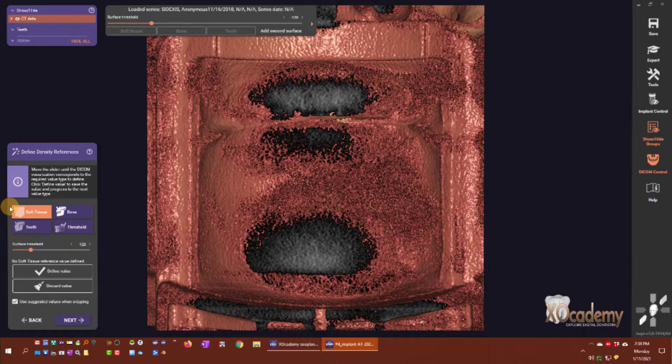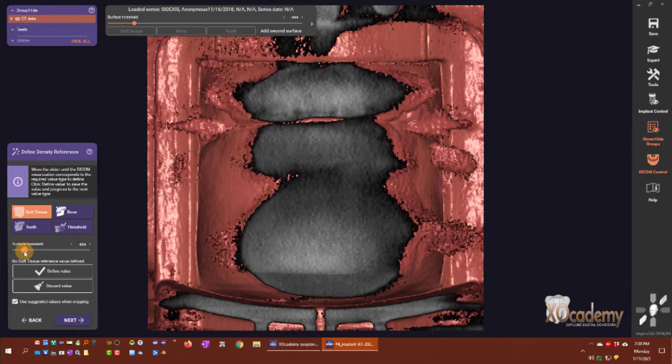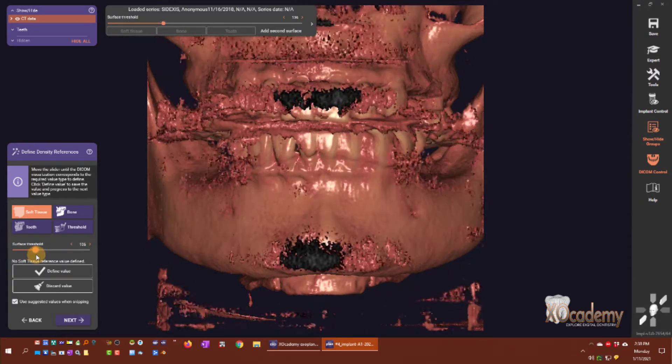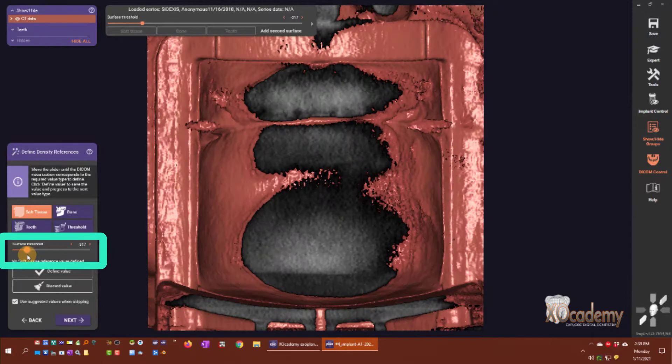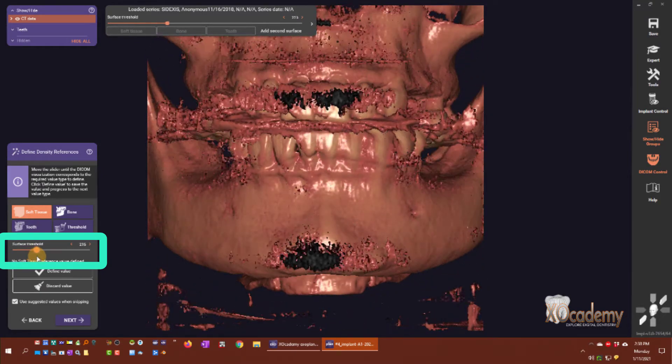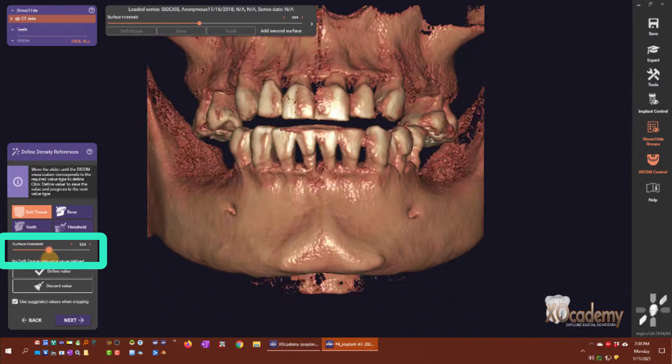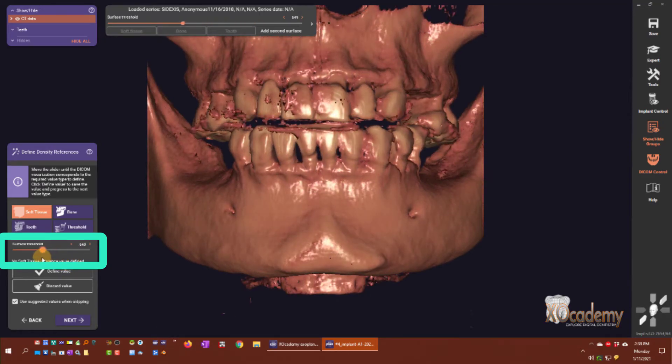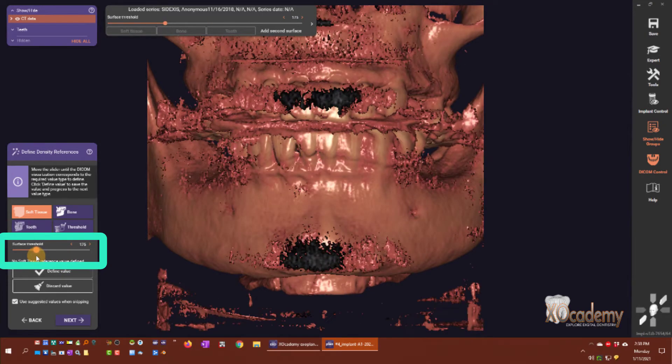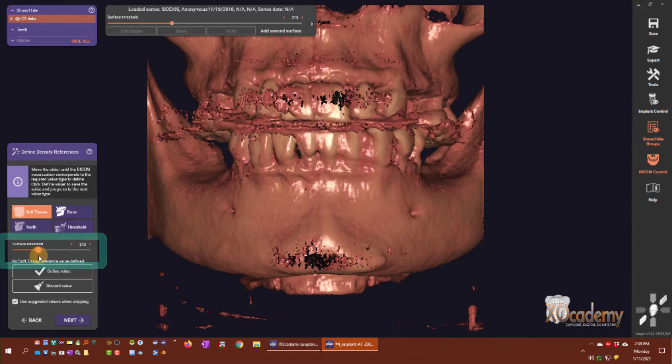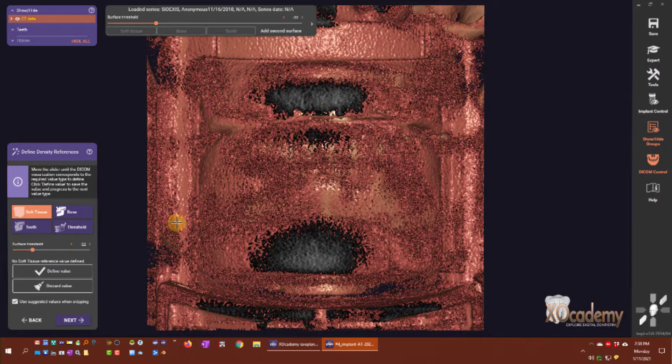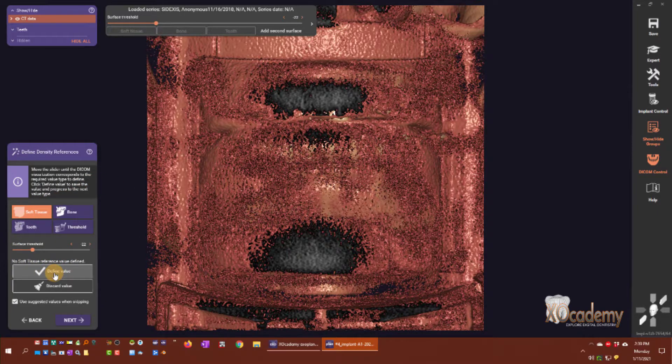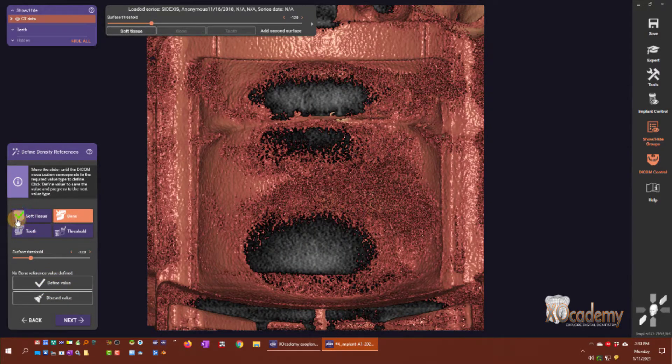With our surface threshold slider bar here, you can see how we can allow certain radio density to show through and eliminate. Once I start to see soft tissue here, I'm going to say that is the soft tissue and click define value. I have a green checkbox next to soft tissue.